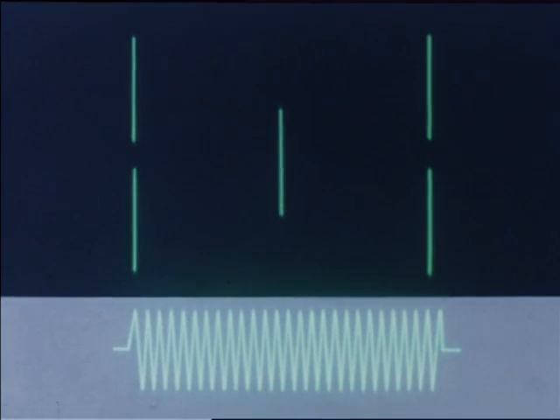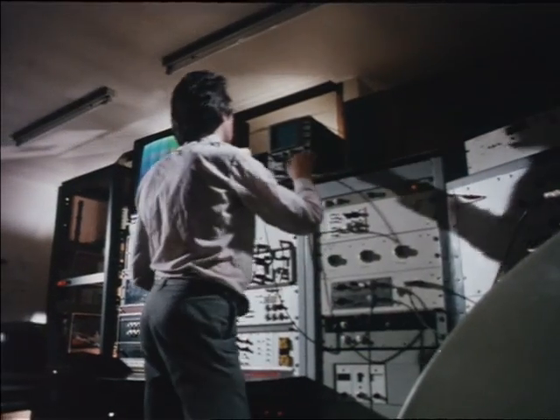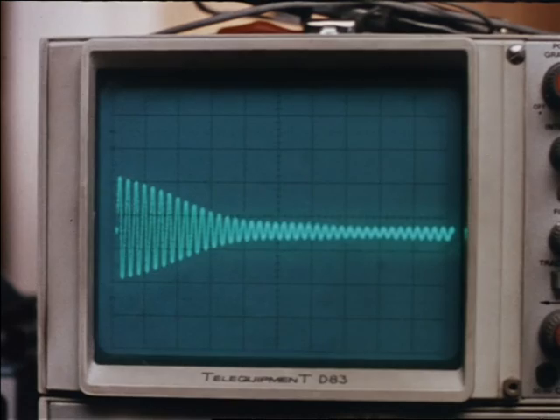But in living tissue there is a lot of water, and that means a lot of hydrogen nuclei all doing the same thing. Sending in a radio pulse will knock the nuclei into different positions, but as they fall back they give out a radio signal. This radio signal can be detected. Here is the signal from pure water, just like the single chime of a bell slowly dying away.